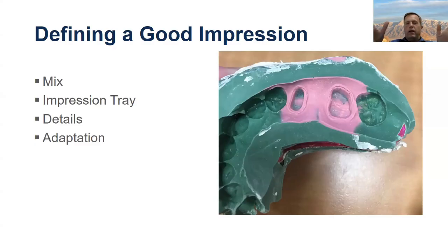And then when we're working, the person who's usually the dentist who's doing the wash material and the assistant who's filling the tray should start at the exact same time. That way the chemical reactions happen when they're supposed to, with better cross linkage and just a nicer impression. One of the scary things about impressions is that they can look awesome and not be, as I'm sure all of you have run into. So as we manage these variables, we can, as much as possible, eliminate the cases where you get an impression like this and you're like, this is the best impression I've ever taken, and then when you try to put in the restoration, it doesn't fit.